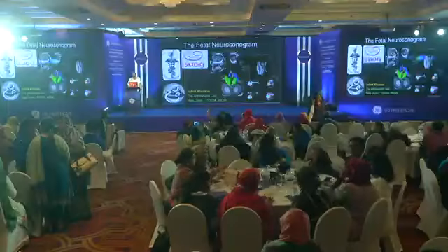Take you through the guidelines that we have, and I will show you how it includes not just 2D, but whenever required, we do a 3D or 3D with or without color. We can do it even in the early trimester, and wherever required, we can use basic or advanced MRI. And the question is, do we still require it?